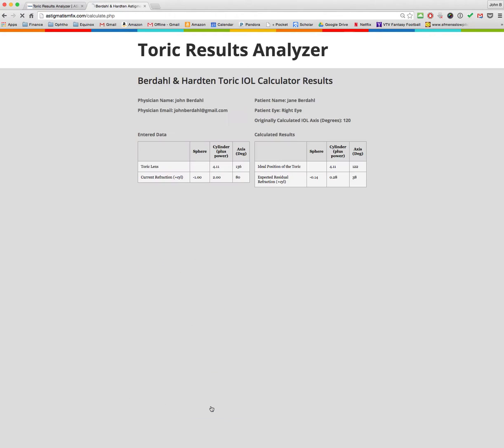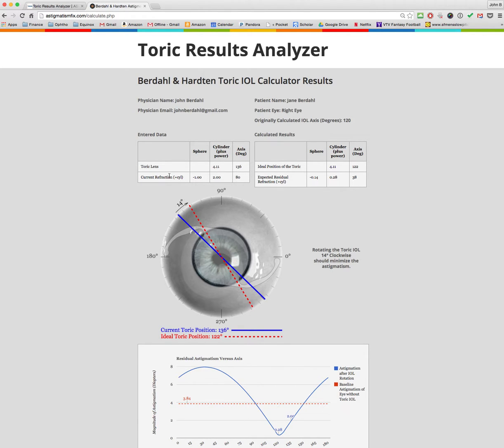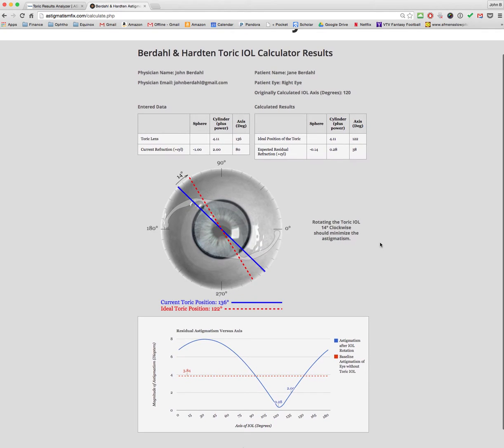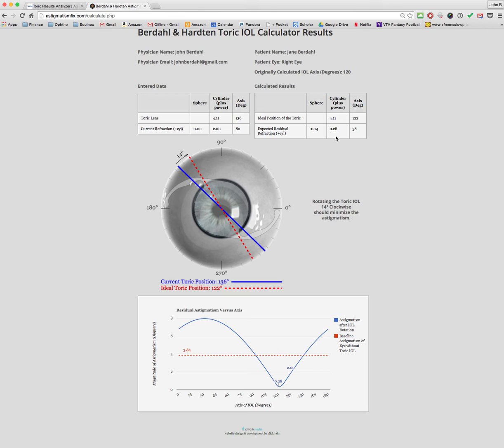Agree to the terms and conditions and hit Calculate. On this page you'll see the refraction you entered — note that it always outputs in plus cylinder. It will show which toric lens you implanted and at what axis, so you can verify the data was entered properly. Here it calculates the ideal position of the toric lens, which is 122 degrees. The calculator suggests rotating the IOL 14 degrees clockwise, which should change the refraction from minus 1.00 minus 2.00 axis 80 to minus 0.14 plus 0.28 axis 38 — taking astigmatism from two diopters to nearly a quarter diopter.